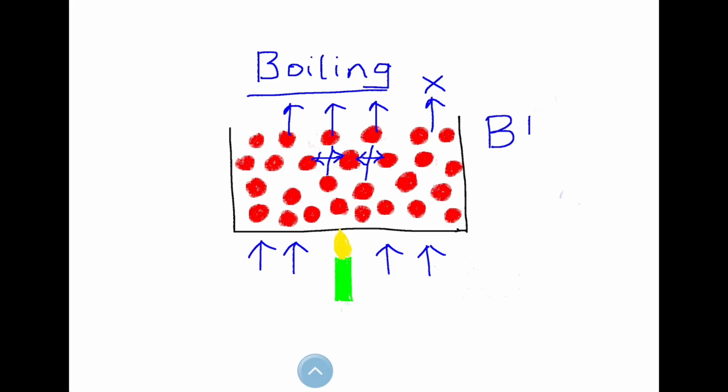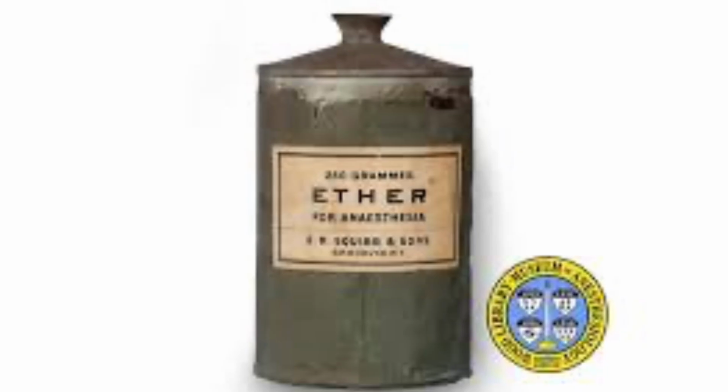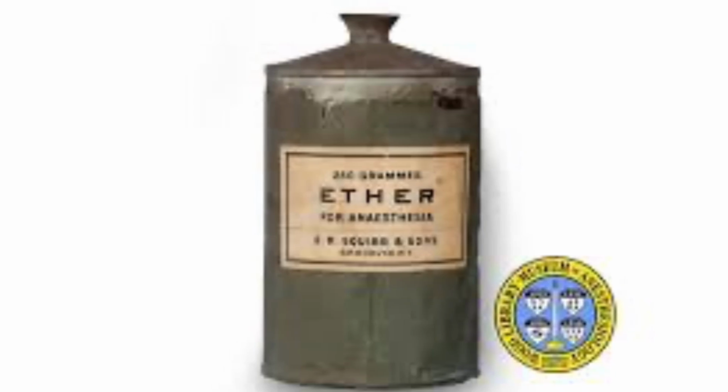the liquid. So, for a given ambient temperature, the closer a liquid is to its boiling point, the quicker it will turn into a vapor. This is because the kinetic energy of the molecules increases as they approach boiling point. Therefore, at room temperature, that is 20 degrees Celsius, a jar of ether whose boiling point is 35 degrees Celsius will turn to vapor quicker than water whose boiling point is 100 degrees Celsius.